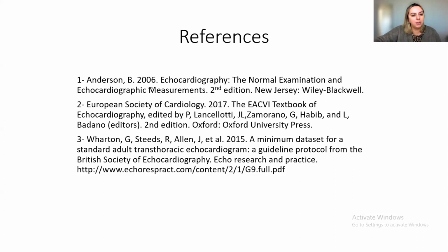Dr. Imam, there's one more question about probe markers. Yes, this is a technical issue regarding the probe markers. For all cardiac exams, you set your machine to the cardiac view, and it is adjusted like that. The marker will be on the right side, and the pointer will be toward the right shoulder only in parasternal long axis, and to the left side in the other views.